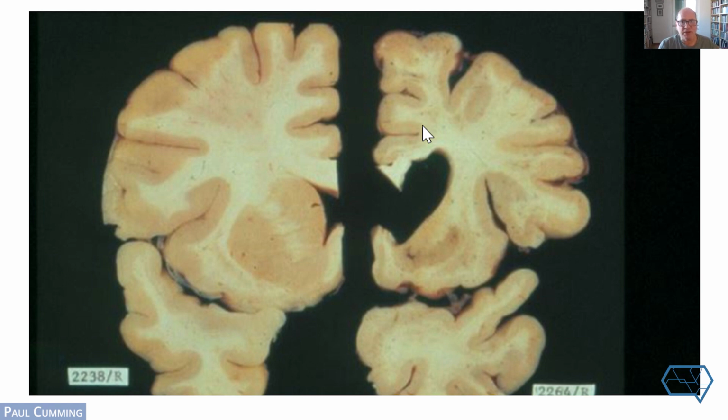You will see, just from visual inspection, cortical thinning throughout due to global atrophy and associated loss of white matter, most notably in the basal ganglia. The well-developed caudate, putamen, and indeed the nucleus accumbens, seen in the healthy left side brain, are nearly completely lost due to the degeneration.